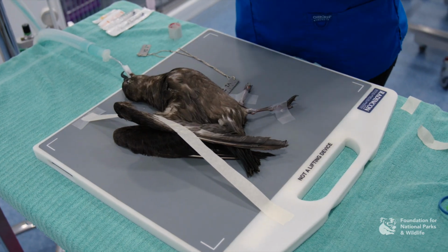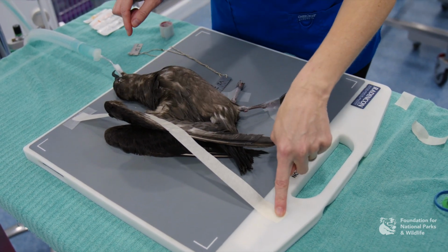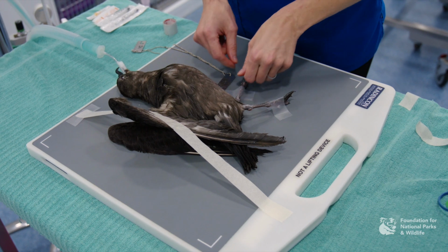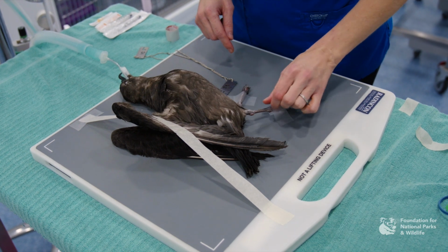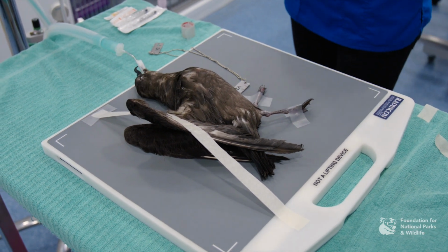So for our lateral view, we've placed our bird on its side. We've tried to get them nice and even. We have put tape over both of their wings. Either have the wings superimposed over the top of each other or slightly oblique. With the legs, pull them down. With the leg closest to the table, you pull that one forward and tape it down. And with the top leg, pull it down and back. Remember, always put your marker down and make sure the neck is nice and straight.